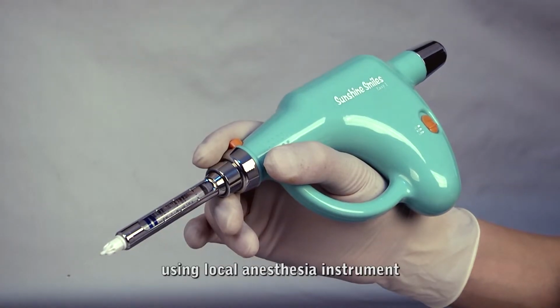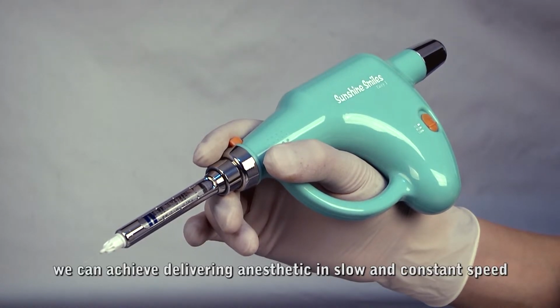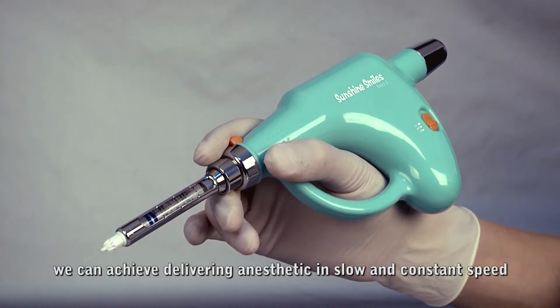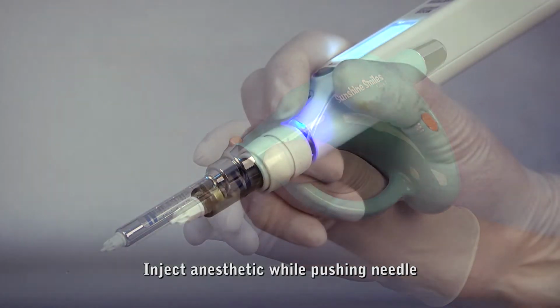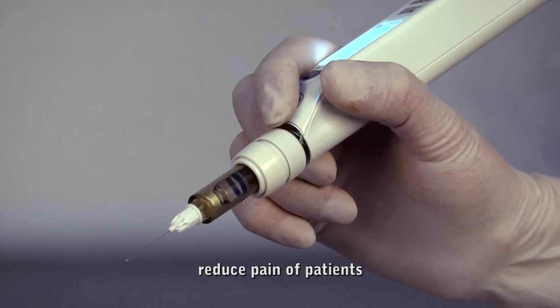Using equipment. Using the local anesthesia instrument, we can deliver anesthetic at a slow and constant speed. Inject anesthetic while pushing the needle, form anesthesia channels, and reduce pain for patients.